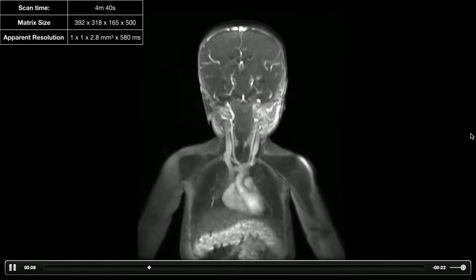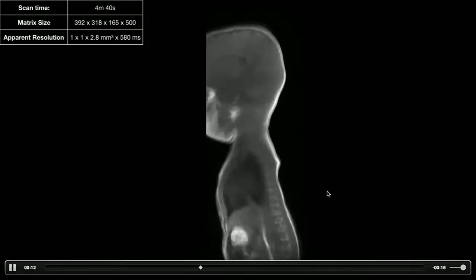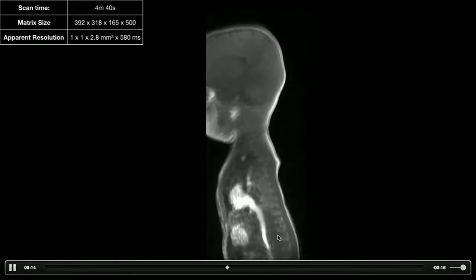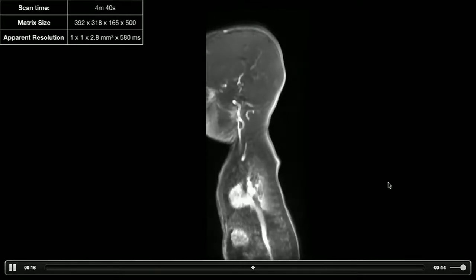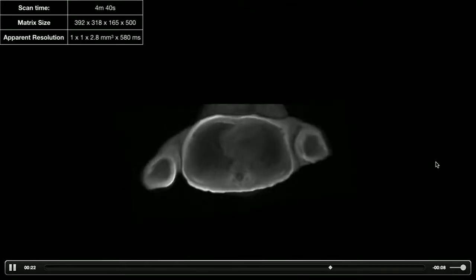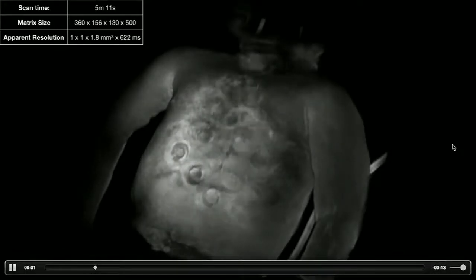Because it's 3D, we can also rotate it to different frames, and you can see the respiratory motion and contrast. One thing to note is that there's actually some bulk motion when the contrast is injected, as shown here, if you look at it again. And so all of these would not be possible to see if we did gated or binning reconstruction. Now, this patient doesn't have a lot of bulk motion, but here I'm showing another example where there's extreme shift when the contrast is injected.